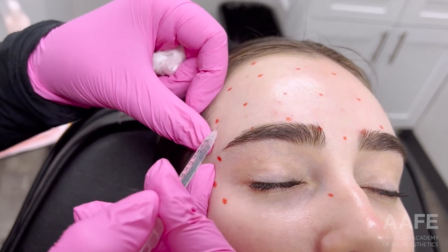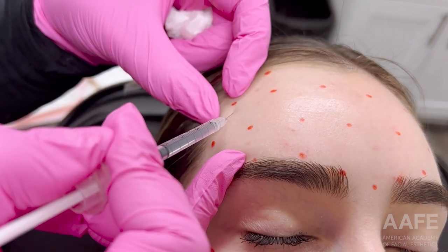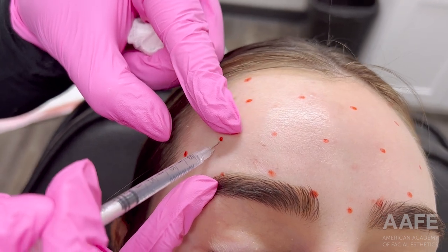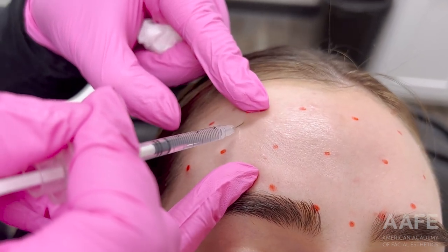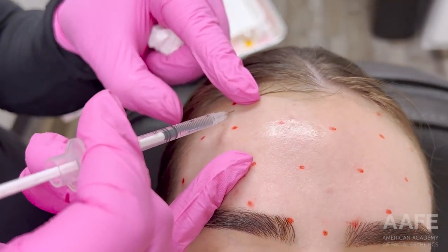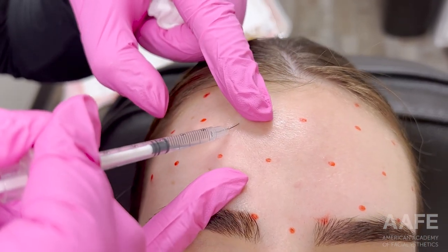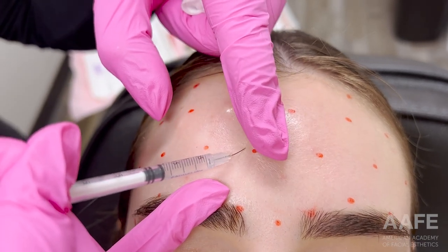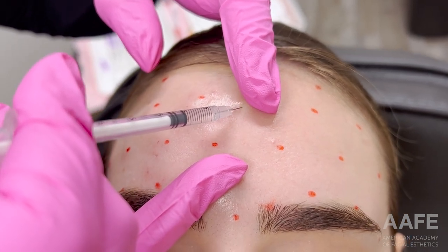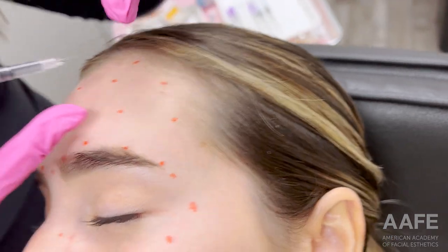In this video we are treating one of our employees, one of our nurses at the AFE — Elizabeth — and she is being treated by myself, Crystal. We are doing full face neurotoxin on her today. She has been treated with us prior and was due, so we already know her dosing and what works well for her. I just cleaned her up, marked her up, and we are getting started. I always like to map out the patient's face with a dry erase marker.